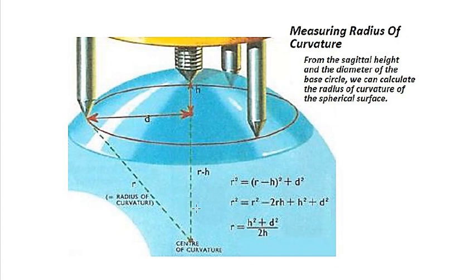You can see your radius of curvature is from here. When you look at this very carefully, you're going to see this spherical curvature. It is a curve, so every curve has a radius, because the entire thing is a circle anyway.